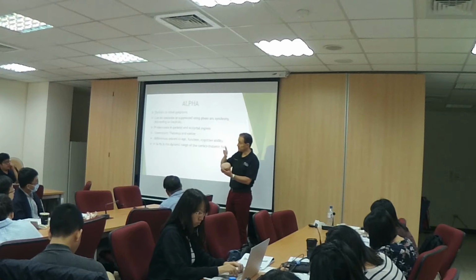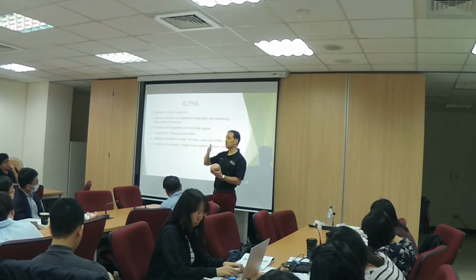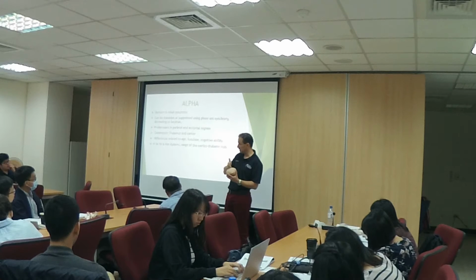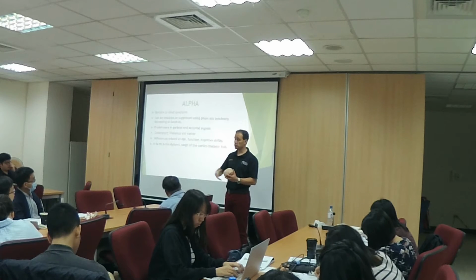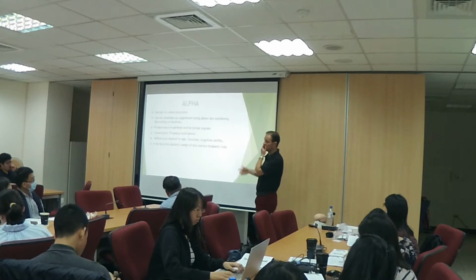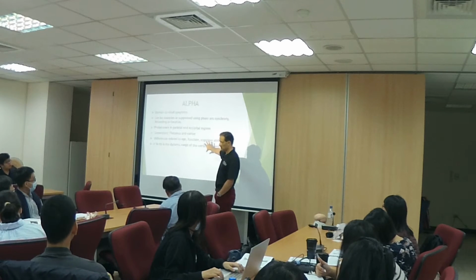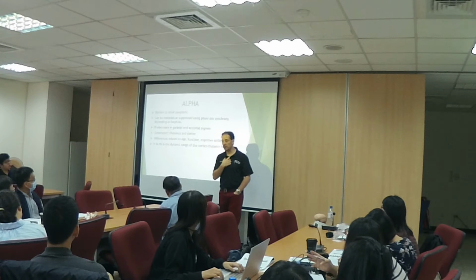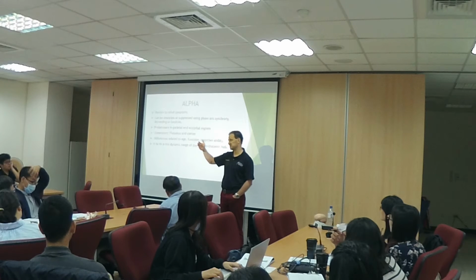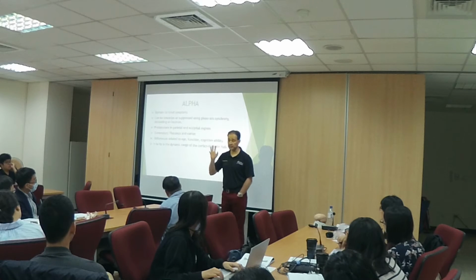Now, for people who are 10 years of age and older, which means all of us in this room, ideally it should be 10 or more. So if you have a client who's 22, 23, 45, 86, and their alpha is at 7, you have a serious compromise. All right? Normally when I see people above 10 years of age and I look at the peak alpha frequency and it is 8, 9, 7, the first thing I do is an IQ test, sorry.